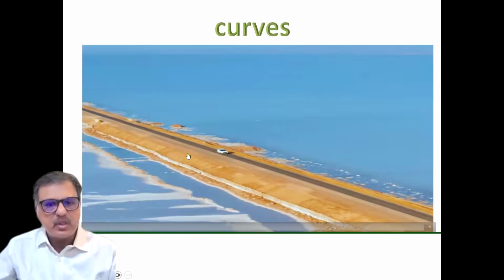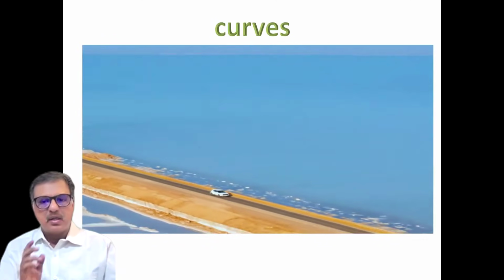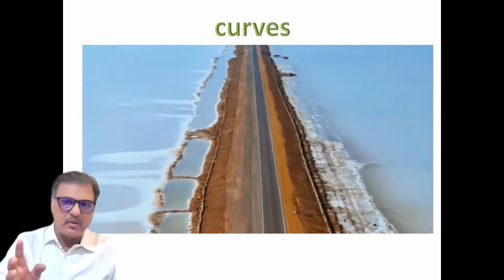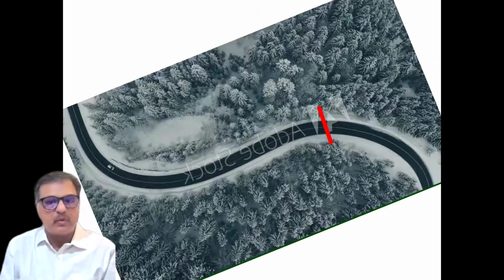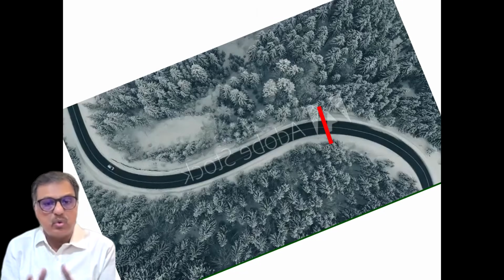When we are using a direct laryngoscope, it is like going on a straight road. You can see far by creating a direct line of sight from the eye to the larynx. But it's not true for a videolaryngoscope. For a videolaryngoscope, you have to travel through a curvy road.